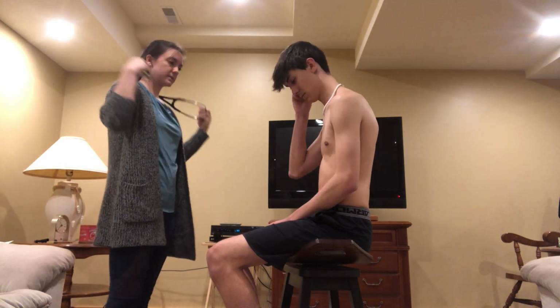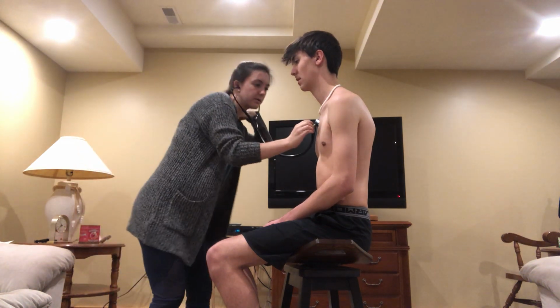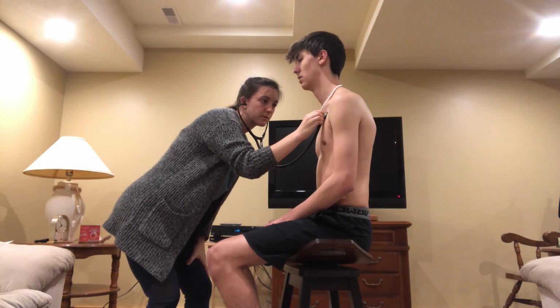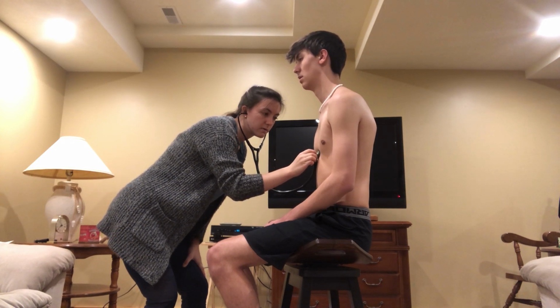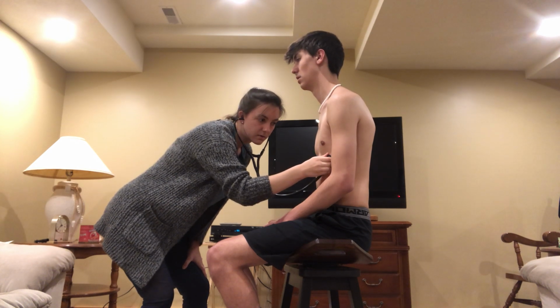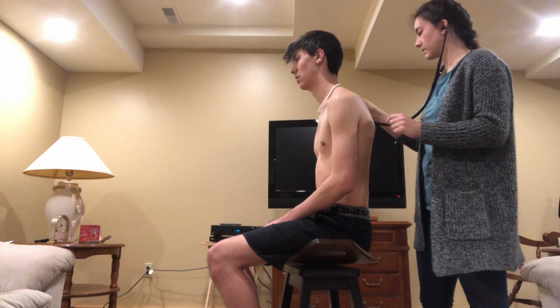And then I will proceed to auscultate 4 posts anteriorly and 6 posts posteriorly, and ask my patient to breathe in at each post with his mouth open. Breathe in. Back, and breathe in.